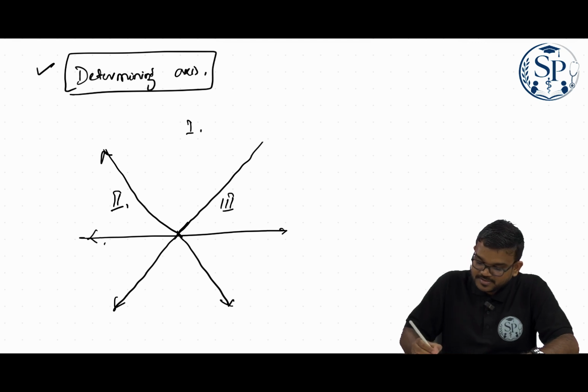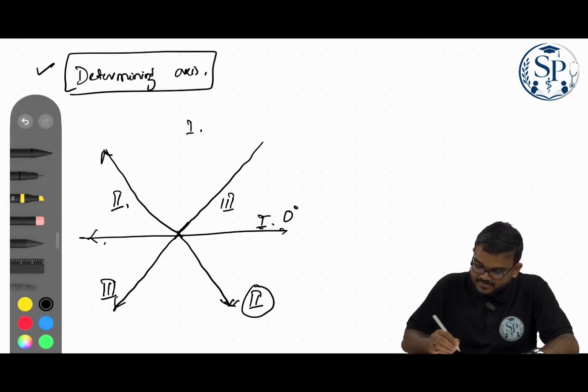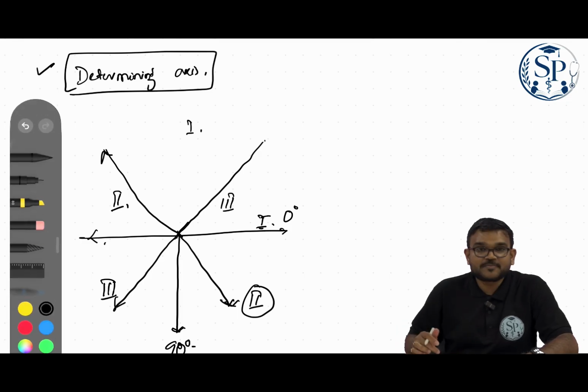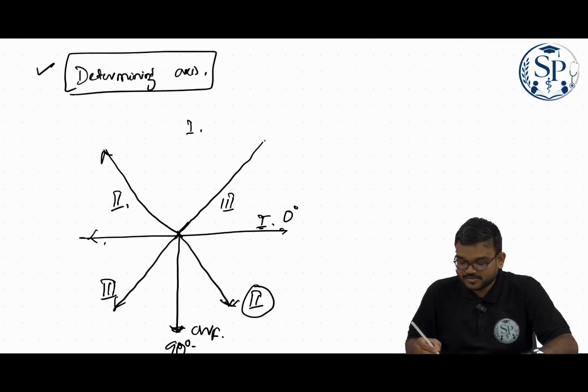Now you can know this is lead 1, this is lead 2, this is lead 3. So lead 1 is exactly placed over 0 degree, lead 2 is the resultant, and lead 3 is beyond 90 degree. This is 90 degree. Okay, whereas if you are putting the augmented leads, then exactly over the 90 degree the aVF lead will fall.